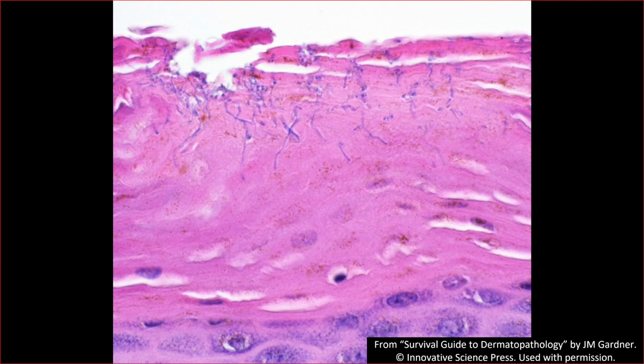That's what you're looking for. Look how I'm zoomed in. This is a 60x high dry view. Not as high as oil, but higher than the normal high power on a microscope. And I still have to really zoom it in to get these little threads. They often are little clusters, or they run kind of vertically, and they are much, much smaller than fungi. You can usually see them on H&E, and they have a blue tint.